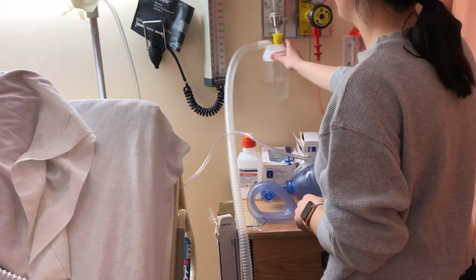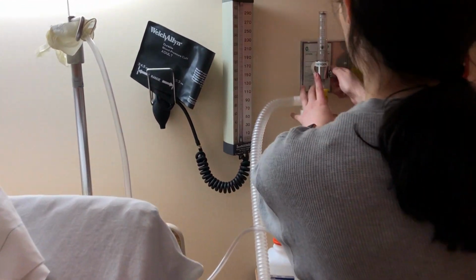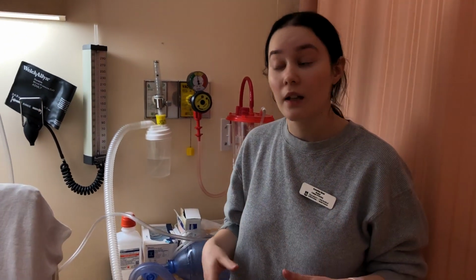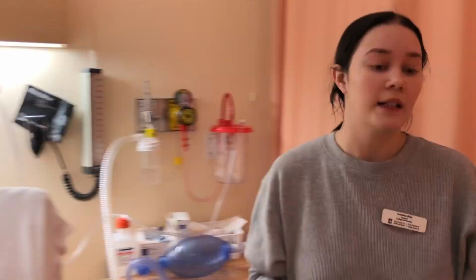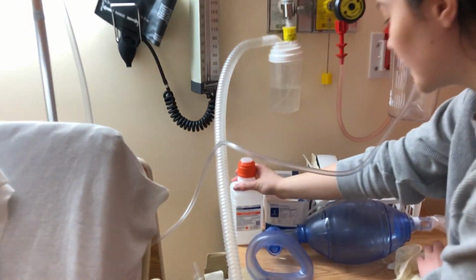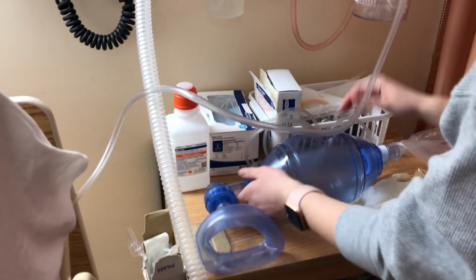Okay, the orders were for 60% cold pot, and I'm gonna turn the oxygen on all the way. I know that with trach care, I should be wearing a mask and gloves. So that you can hear me for the purposes of this demo, I'm not gonna be wearing a mask. So I am gonna get gloves. Okay, I'm just gonna make sure, so we have normal saline at the bedside. I have the Ambu bag.